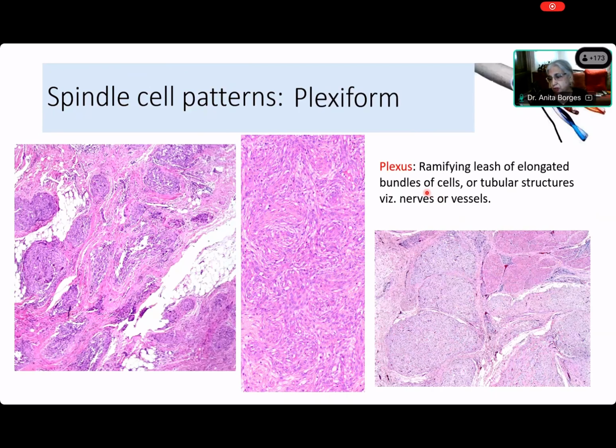Yes, it's a plexus. You know what is a plexus? We have lots of plexuses in our body, and the plexus may be a vascular plexus, it may be a nerve plexus, it may be a plexus of many different things. Okay, and it is a ramifying leash. You know what is a leash? There, I showed it to you on the right. It's like the cables in your home. You have multiple of these wires that are enclosed in some kind of bundle. So you can see the outlines of the bundles. You can see here also the outlines of the bundle.